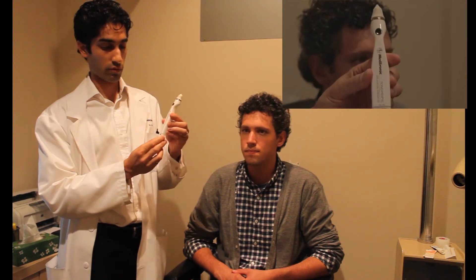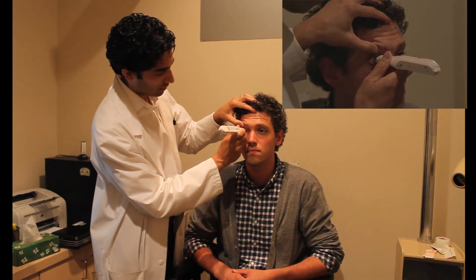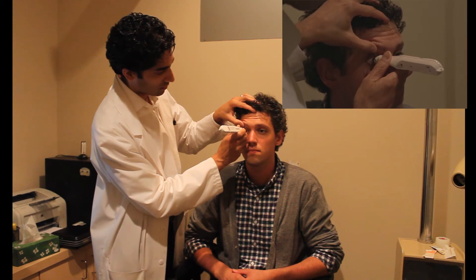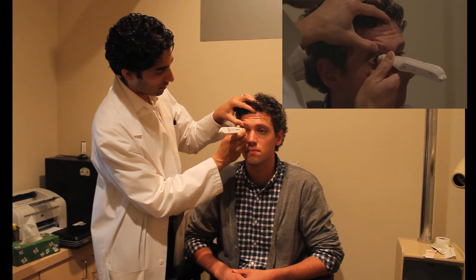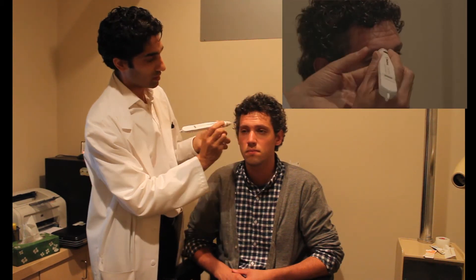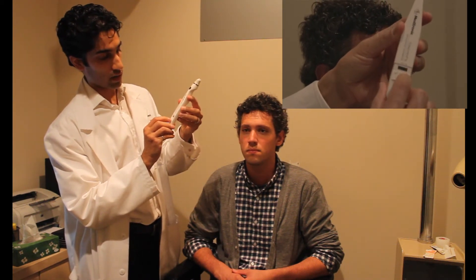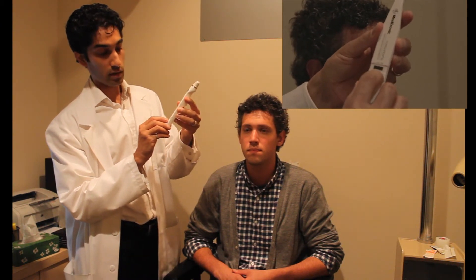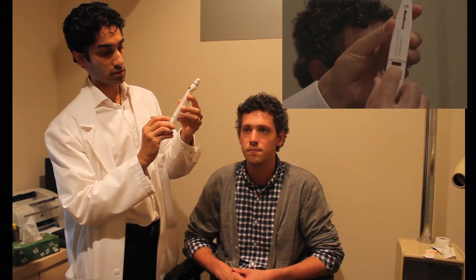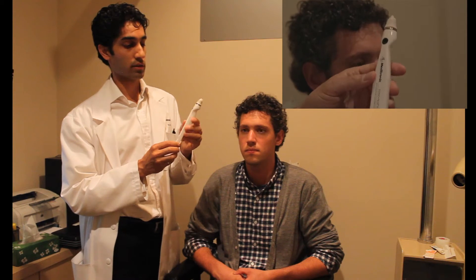When you see the two bars you're ready to go. Come in from the side and have the patient look straight ahead. Repeatedly dab the cornea right in the center — you'll hear short beeps with each valid reading. When you hear a long beep, it has registered a pressure after taking multiple measurements. In this case it reads 18, and there's a small bar at the bottom overlying the 5% indicator, meaning the reading is 18 plus or minus 5%. The display also has indicators for plus or minus 10%, 20%, or greater than 20%, giving you a sense of measurement reliability.